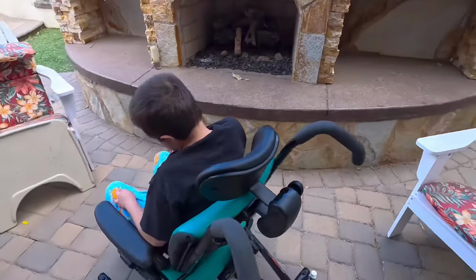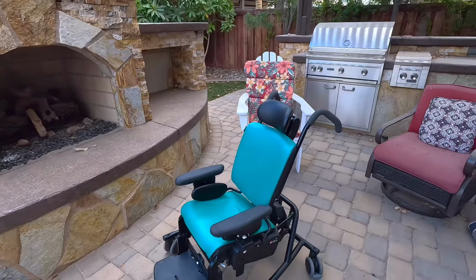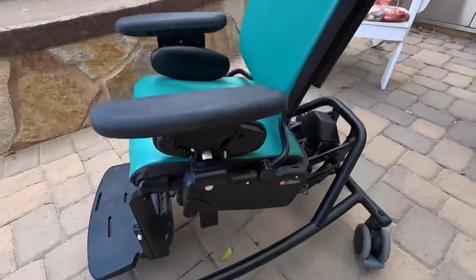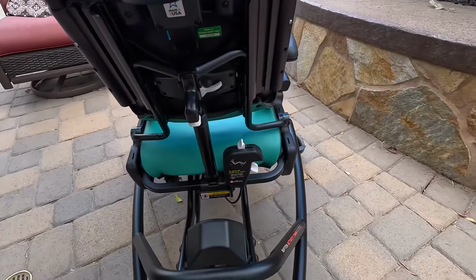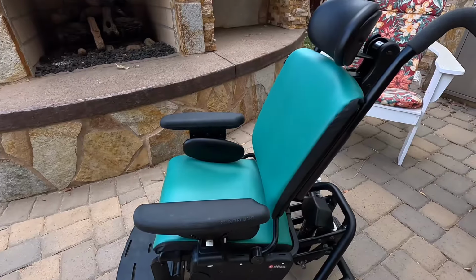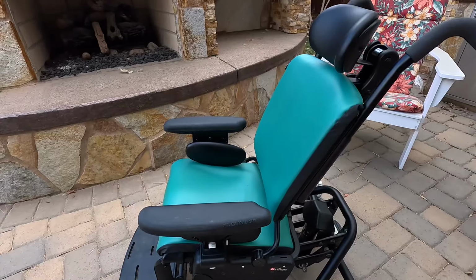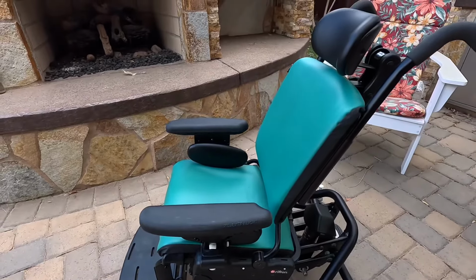Okay, at that position where it's pumped 5 times, Billy has the easiest way to get out because he's not really having to lift his body up. He's just more or less sliding forward onto standing level. And you can see there's a lot of little white buttons and triggers, and it's very important that none of these things are ever touched, because all these are to make adjustments to the chair, and his chair has been adjusted for his condition and for being in the chair so many hours a day. So it's all tuned in. But if anything should happen, and sometimes something accidentally gets triggered, then just reach out to me and I can restore it back to the proper setting.